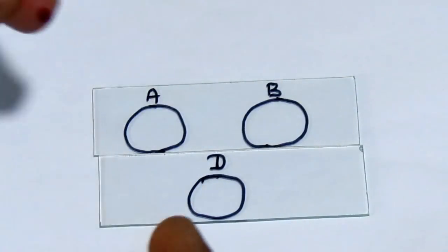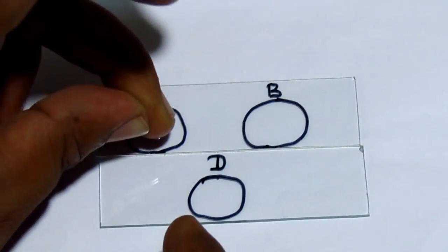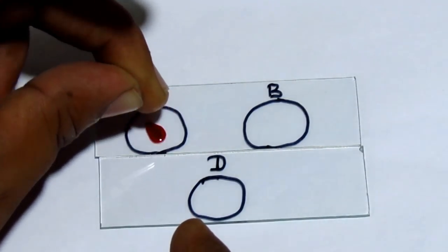Now put two to three drops of blood respectively on the positions marked on the slide.